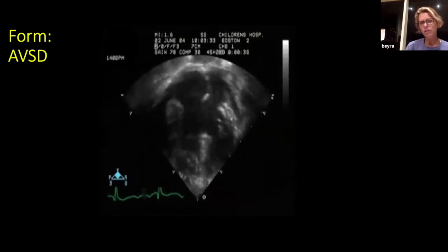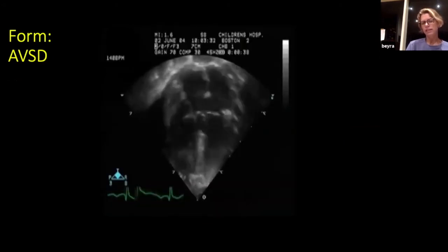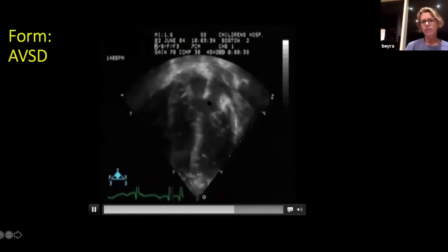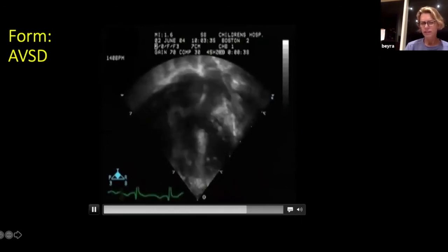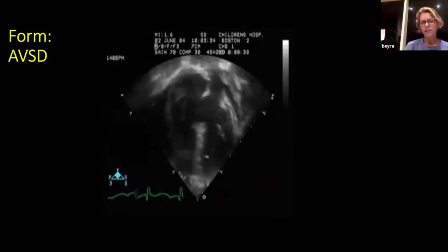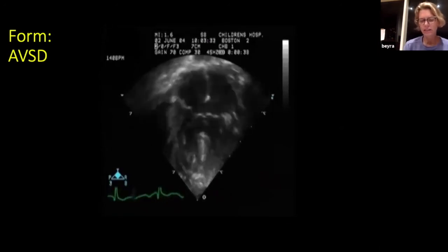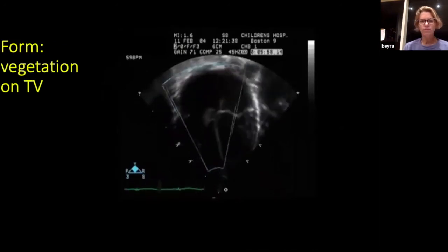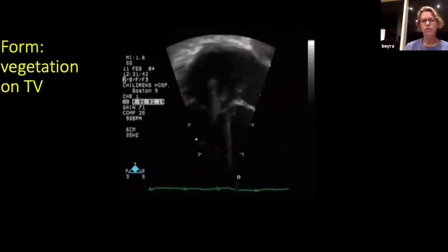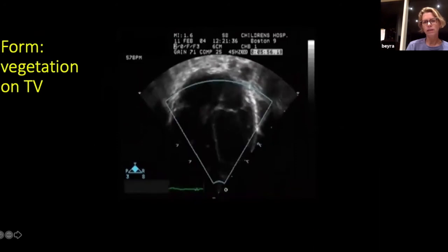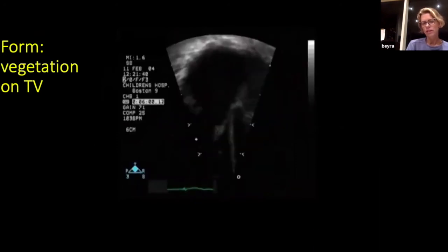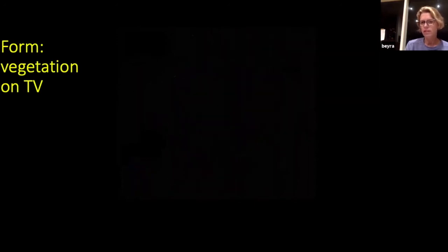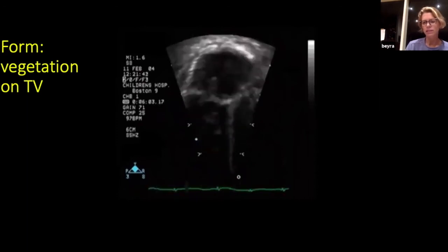In another four-chamber view in the normal anatomical position, you can immediately see a hole in the atrial septum, a hole in the ventricular septum, and a funny-looking valve - this is an AVSD and the ventricle is volume-loaded; you need to start antifailure treatment. You don't need to be a cardiologist to recognize this. In another four-chamber view, you can see a large vegetation flopping in and out of the tricuspid valve obstructing flow - this looks like infective endocarditis. You need to start blood cultures and antibiotics immediately, and get your cardiologist involved.